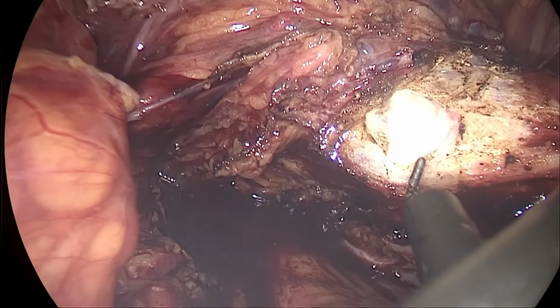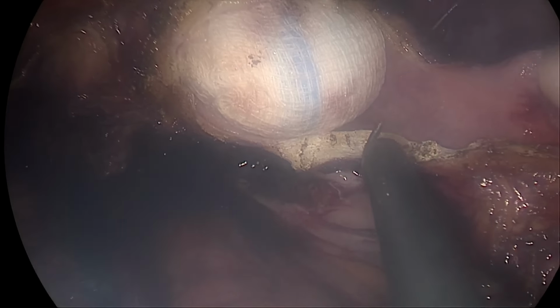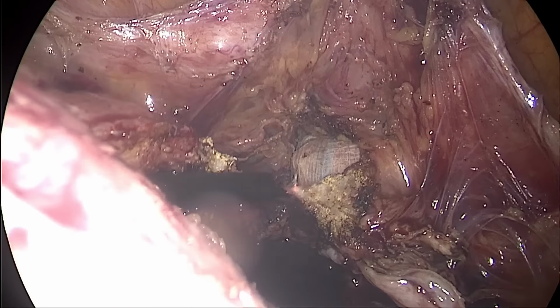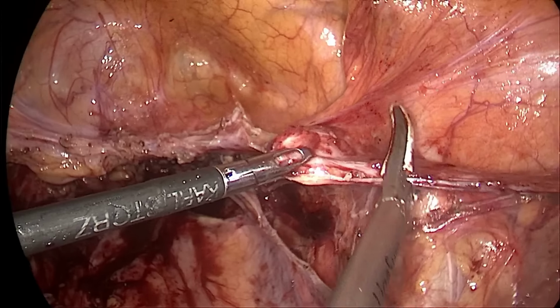So that's our sponge stick coming up. With the help of the monopolar, I am opening up the vault. The anterior part of the vault is gone. Now on the posterior part, the last part of the vault remains. Yes. So that's the end of the hysterectomy in this case.